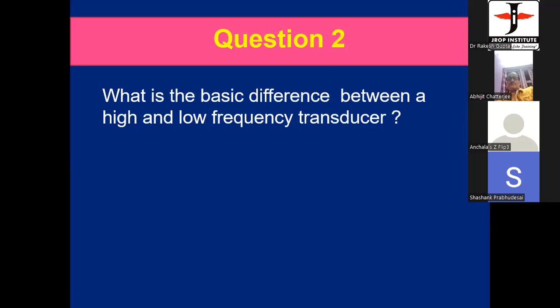And what is the positive point of a high frequency transducer? Resolution will be better, sir. Penetration will be less. Resolution would be better at what place, near or far? Near point, sir. Okay. Fine, Jaising.